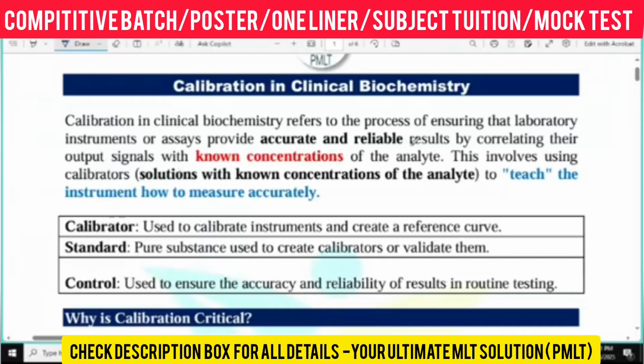Calibration is basically a procedure which ensures that the laboratory instrument provides accurate and reliable results. Accurate means the result should be fully accurate, the right result.